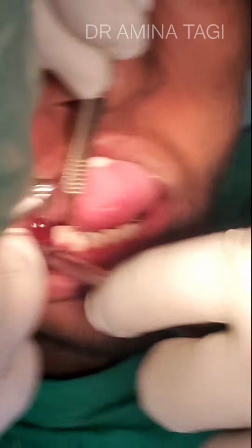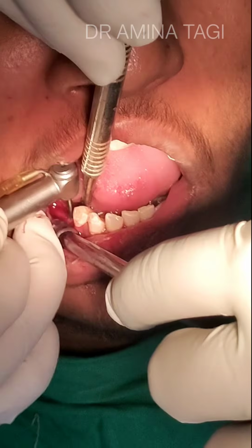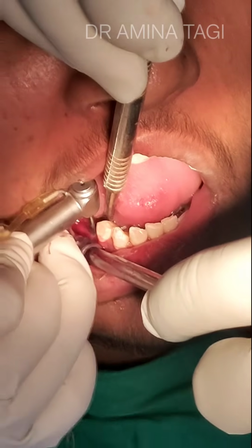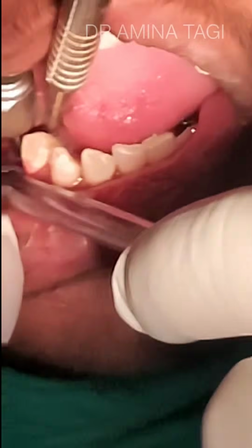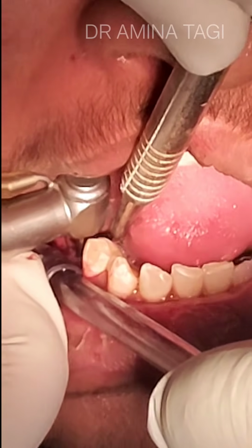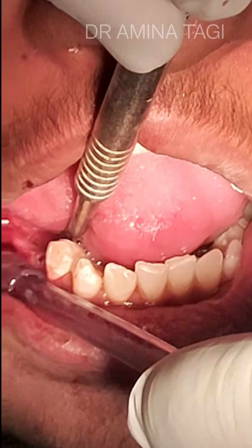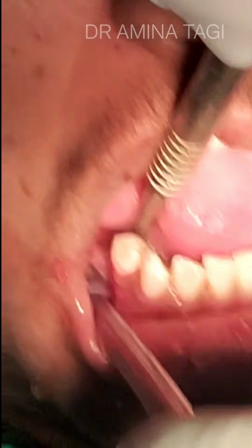Place this as parallel as possible to the adjacent teeth, maintaining a gap of 1.5 mm so that the PDL fibers are not damaged. I hope you can see the ditch that I have made in the video.